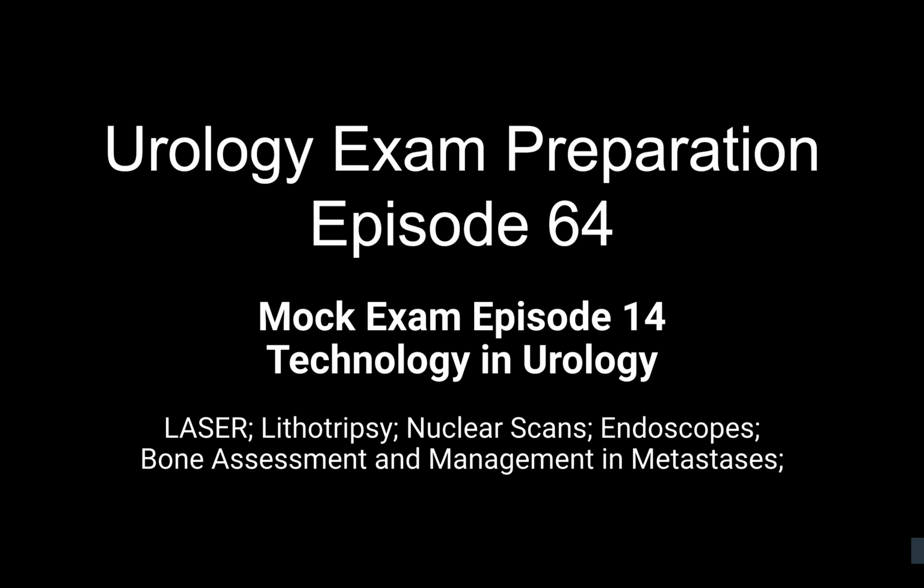So pulse energy means that a laser can either have a continuous output or a pulsed output. When the pulse duration is decreased, more energy is given out in a very short period of time. That is the main difference between a continuous output laser and a pulsed output laser.